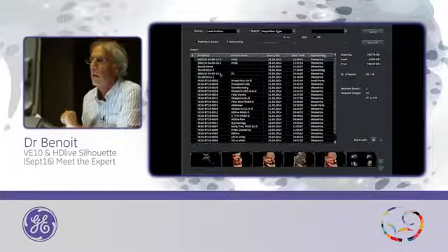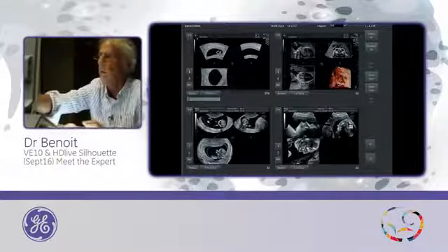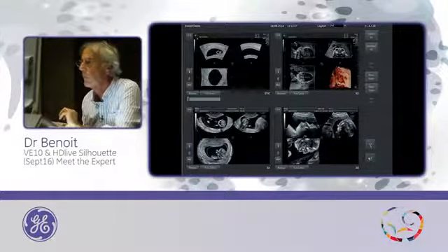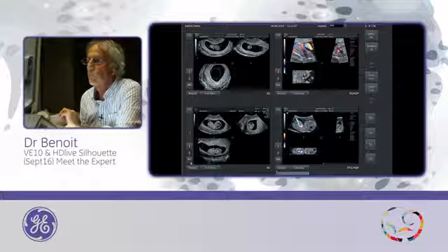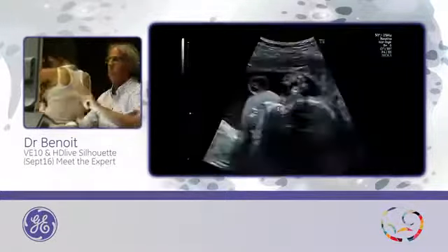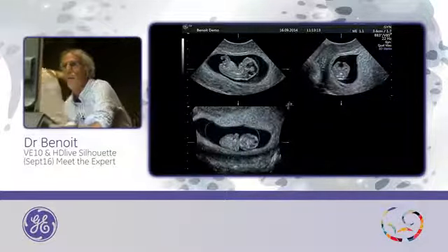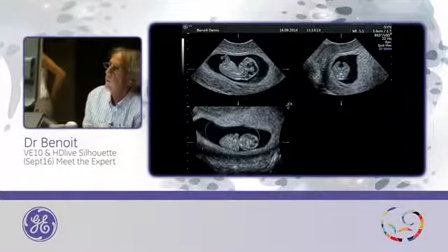So, archive. We will start with this one. How many weeks is this embryo?